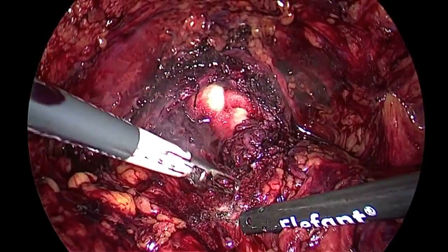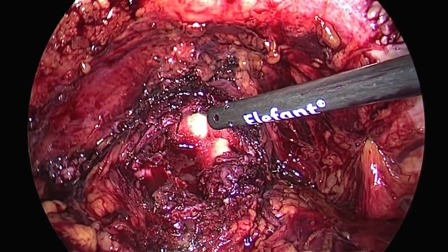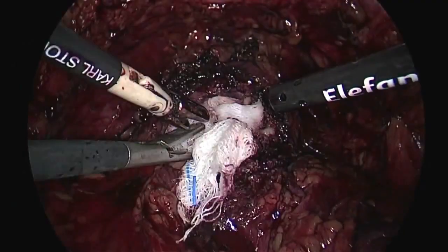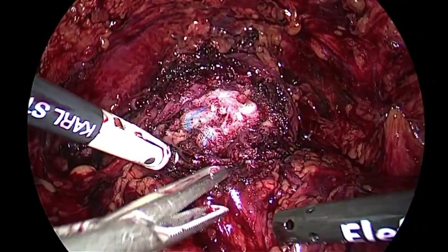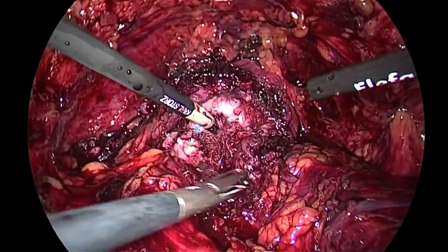sometimes, potentially, there is the risk of leaving stones inside the bladder. But if there is one big stone, I think you can remove it without difficulties. Sometimes it could also be useful to perform a larger incision, prolonging the incision here. But usually if I push the bladder in this way, okay? The stones usually appear at the level of the bladder neck.